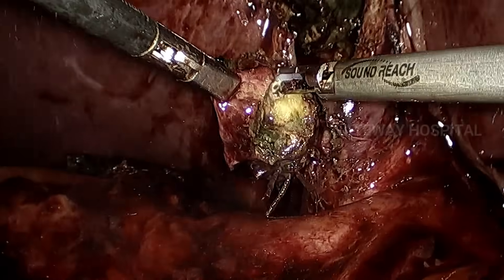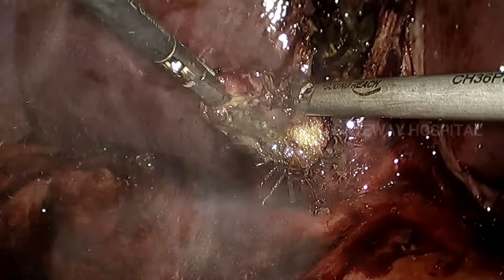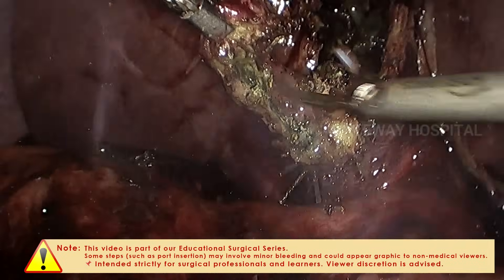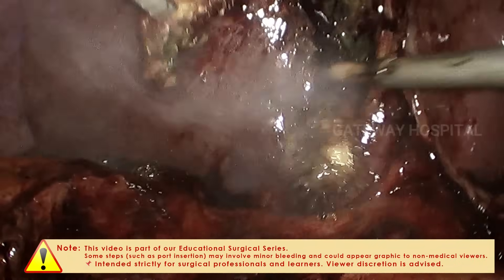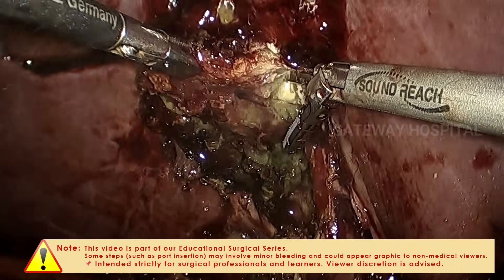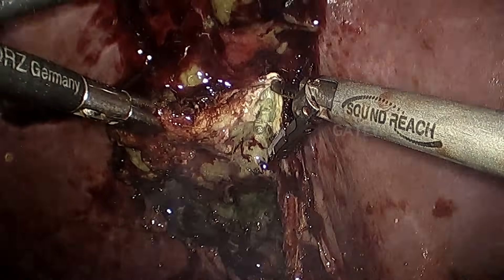In this sort of gangrenous gallbladder, most of the time the cystic artery will be thrombosed, and the harmonic scalpel is very useful in dealing with these cases. Once the cystic duct is ligated, we move towards the separation of the gallbladder from the liver bed, using the active blade of the ultrasonic shears to separate it.